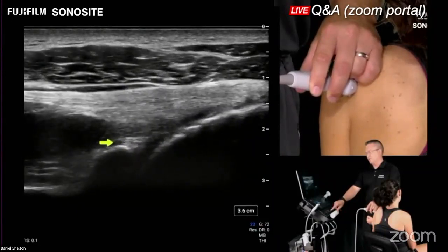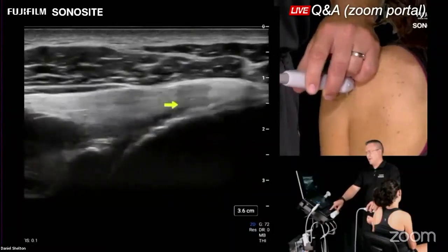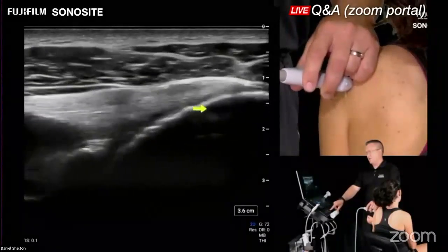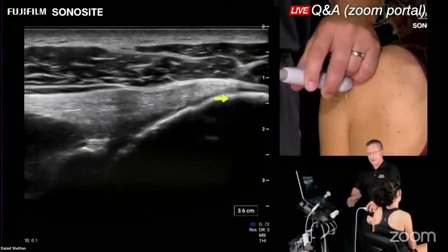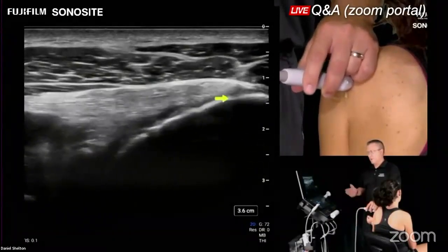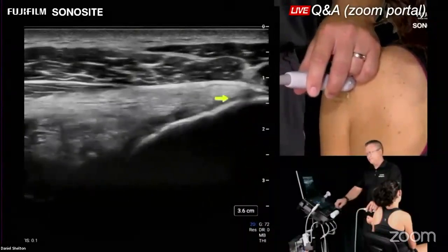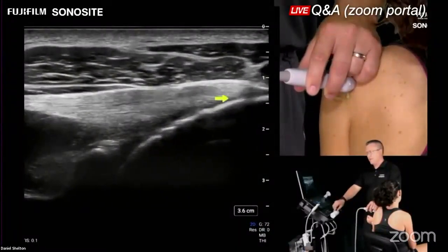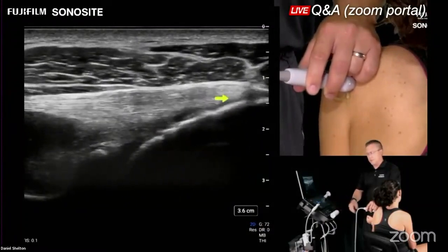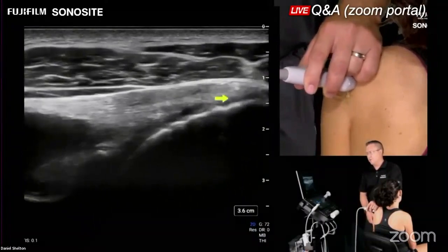So I'm pointing at the capsule's interface. This is the central tendon of the infraspinatus. We have gone into external rotation, which has brought the enthesis posterior. So this is the anatomical position. If you're looking at an anatomy poster or book, when we're in external rotation, we expect to see the infraspinatus back here. Thing is, when we do these exams, typically the patient is in a relatively neutral position. So let's watch where the infraspinatus goes.